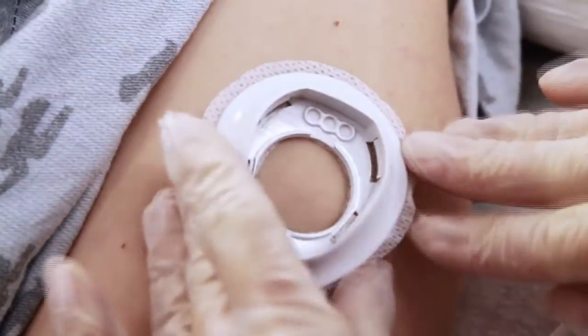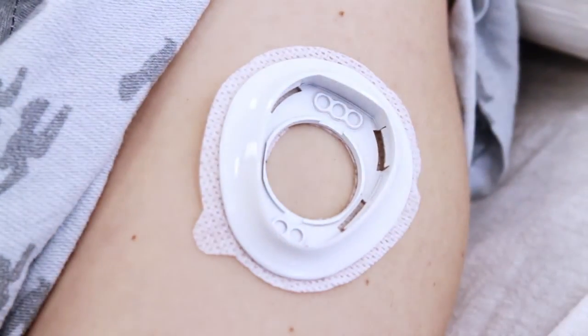A sensor base is attached to the patient, exposing a small area where the sensor will contact the skin.